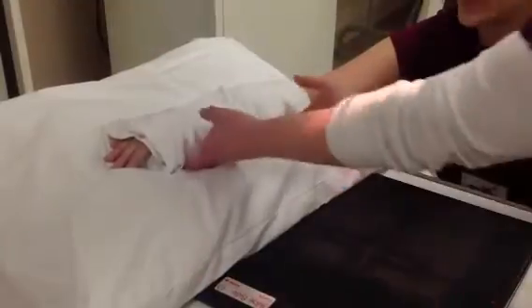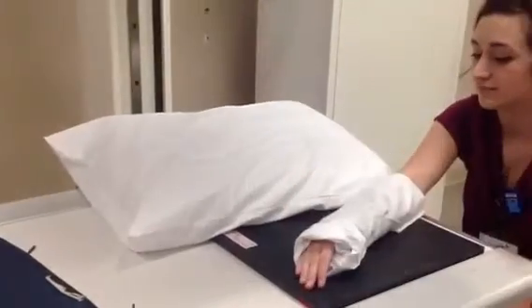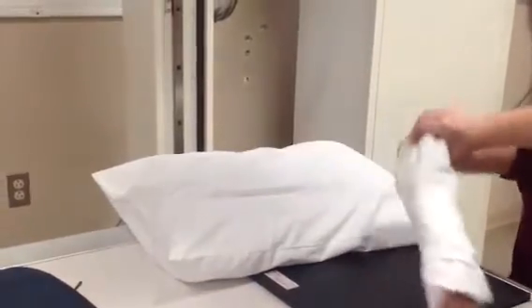Here are some good examples of how not to handle a cast. You should avoid movements that are too rough or too fast, and always avoid pinching the cast between your fingers. You should also avoid improper joint support. Always be sure to use 2 flat hands and offer support at both ends of the cast.